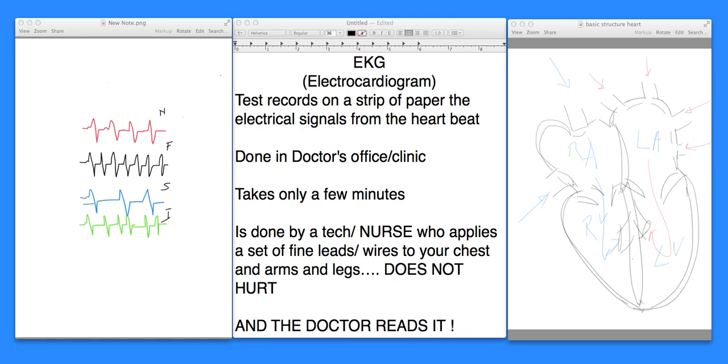Here the heart rate is very slow. Beat, beat, beat. You see? So that's a slow heart pace. Here the heart rate may be only about 40 a minute. And then you have an irregular heartbeat, and this is the fourth example where the beat is beat, beat, beat, beat, beat, beat. You see how irregular that is? It's sounding irregular also while I'm saying it.